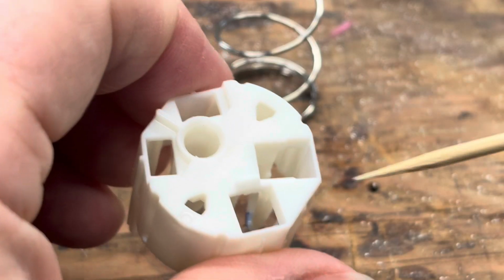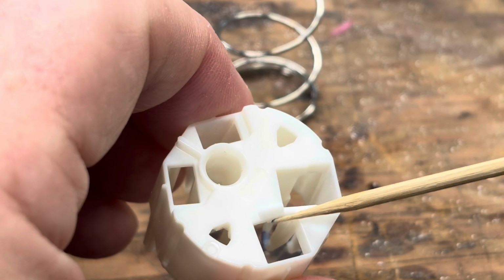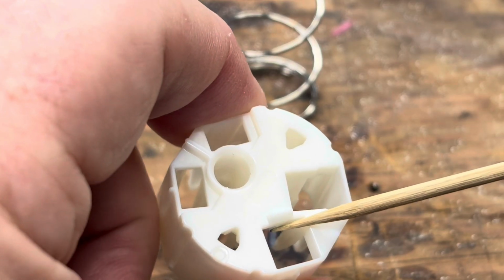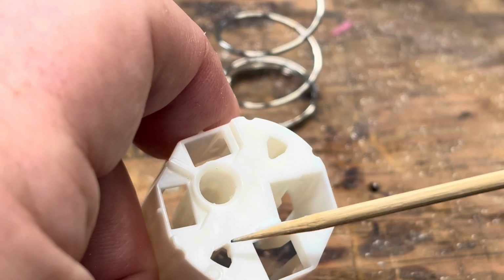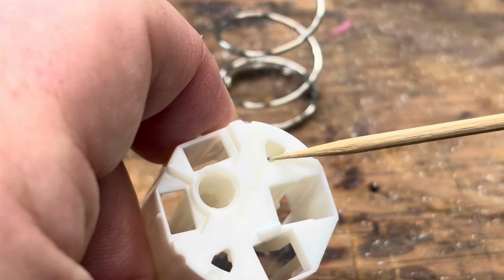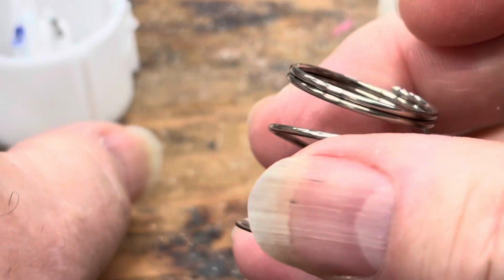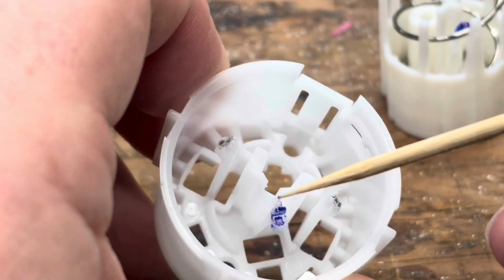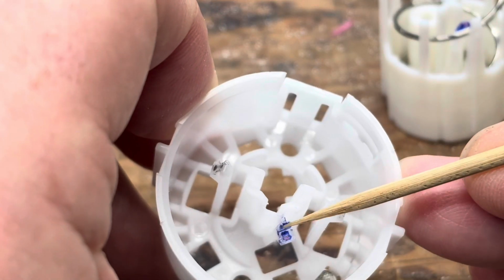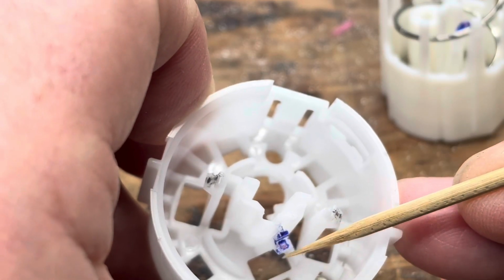You'll need to notice this square ledge, I'll explain later, is caught by a finger out of cup 2. And these are what I'll call the pinch receptacles. I'll explain more about that later. Then there's a spring that goes between 3 and 4. Cup 3. The blue loop I showed you fits around. To reassemble these, I have to slide it around that hook.